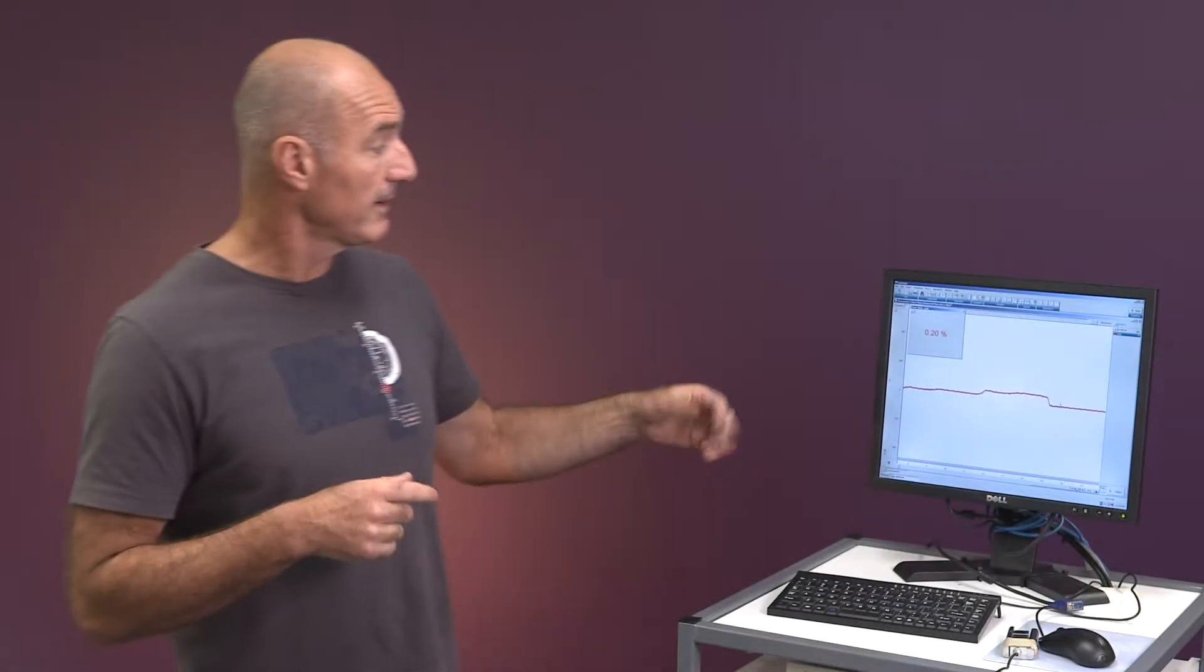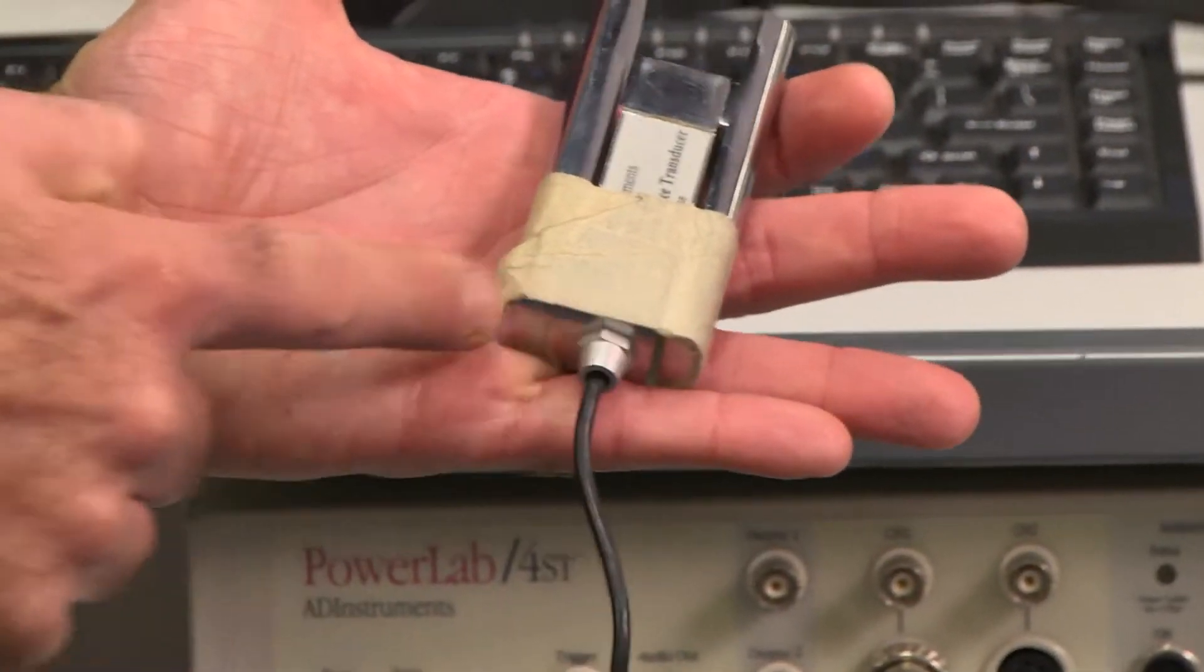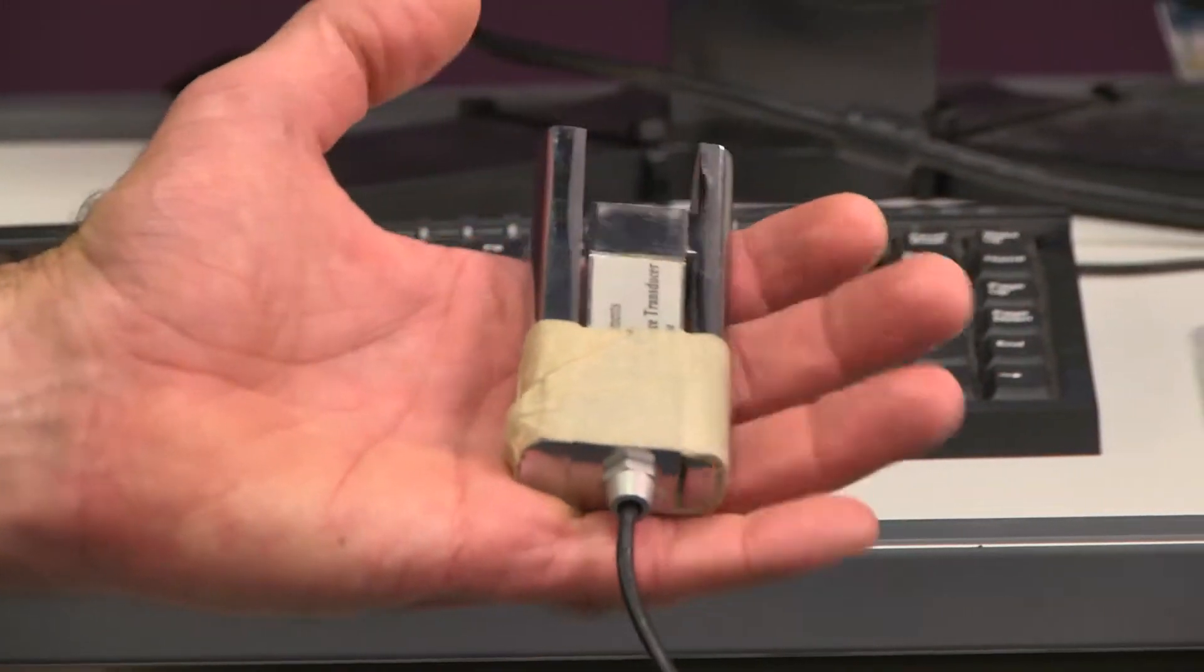Now what you'll do here is we've got this nice hand grip dynamometer, it's an electronic one and probably the important teaching point here, make sure you grab the bottom.